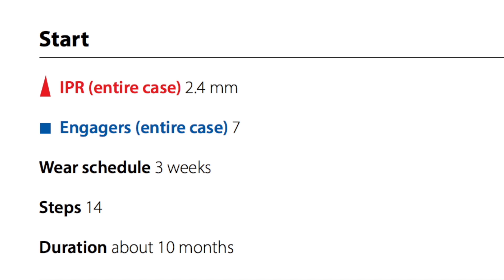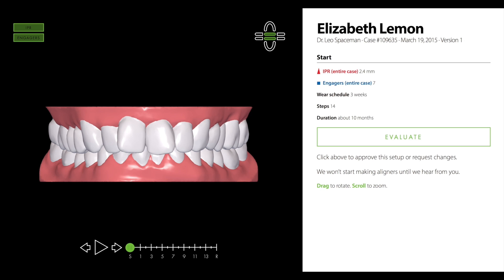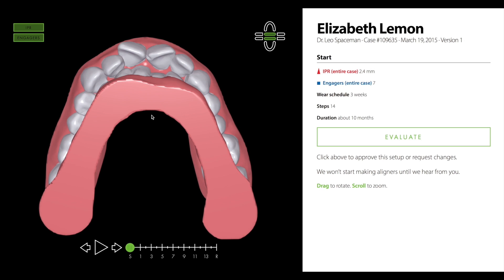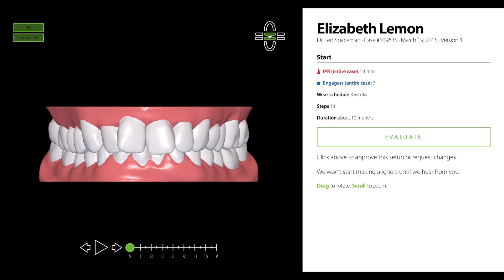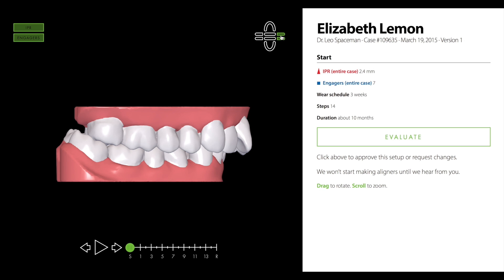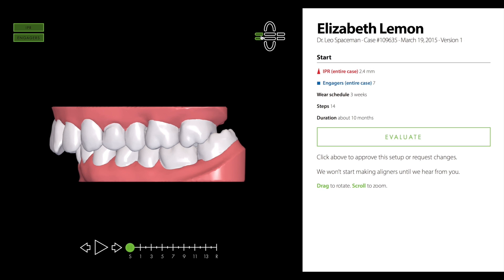You'll want to start by confirming the accuracy of the model and bite registration. Put the timeline in the starting position and tilt the model up to check for gaps between the upper and lower incisors, as this often indicates an improper bite registration. From the front angle, check the midline relationship. Use the right and left views to verify the overjet, overbite, canine, and molar relationships.